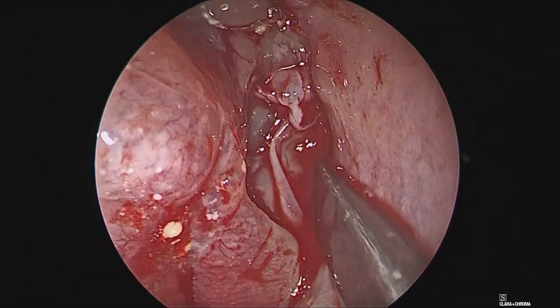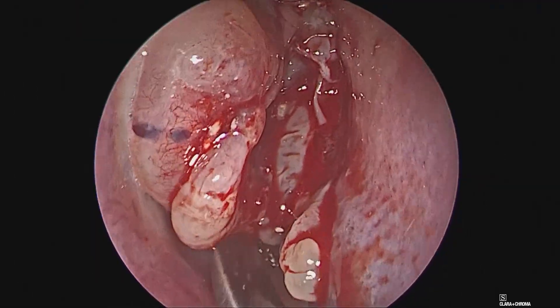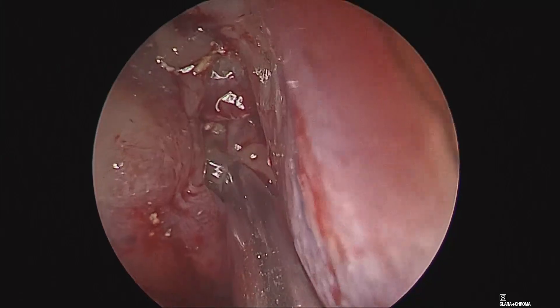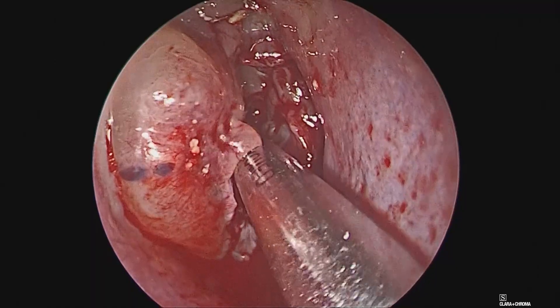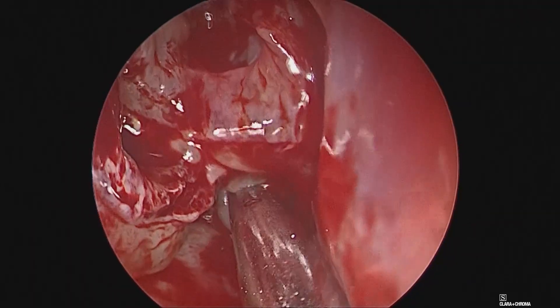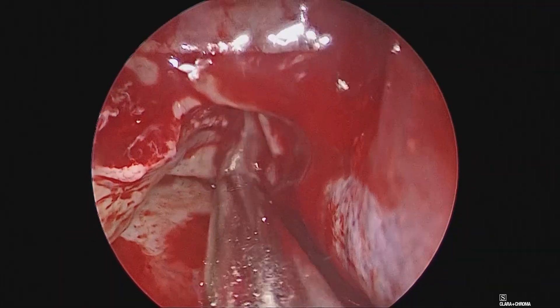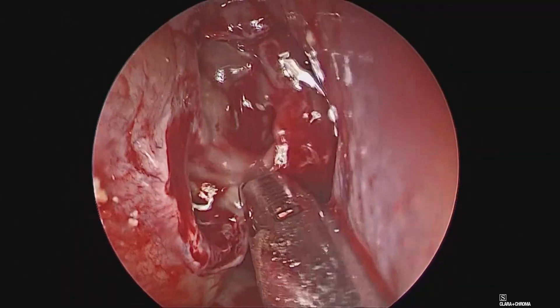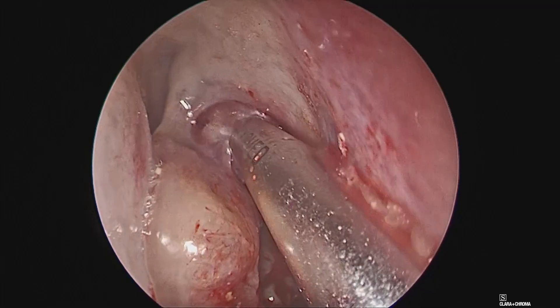These cases are not generally invasive. However, as a continuous spectrum, there is no harm in obtaining adequate cultures. The spectrum of fungal disease from allergic fungal to mycetoma to invasion is actually a continuous one, and sometimes the same patient has exhibited more than two pathologies even on the same side. So whenever there is suspicion of a difference in tissue texture or tissue adherence to surrounding bone or excessive erosion, one should obtain that specific tissue, label it correctly, and send it for histopathology to find signs of any possible fungal invasion.